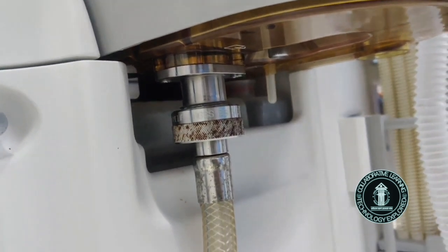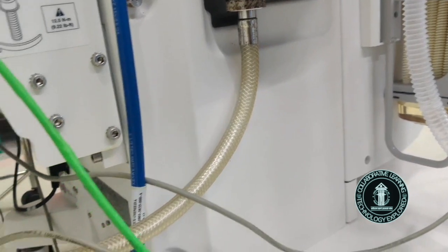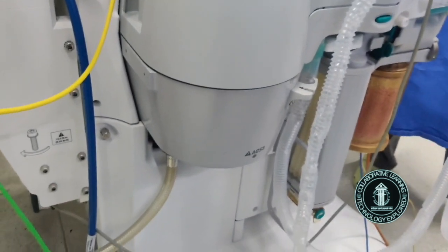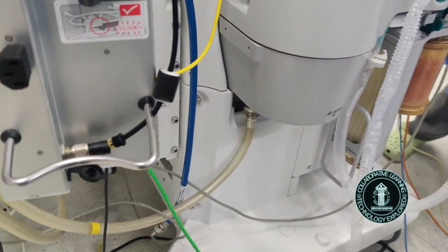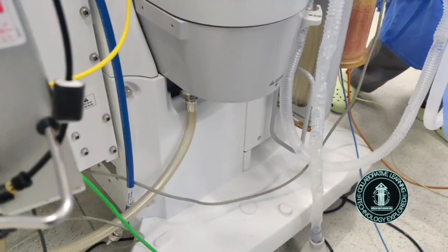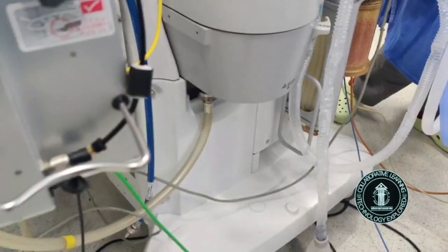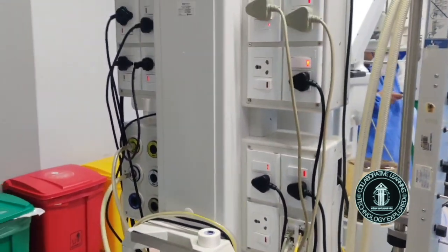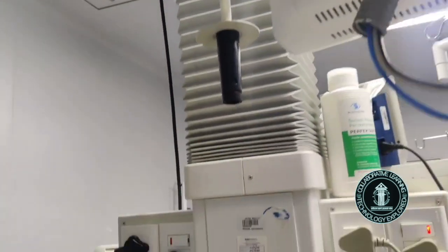And most of these disposal systems have a terminal unit, which is far away from the operating room environment, that may be placed on the rooftop or terrace. As we have explained, you cannot see the collecting or receiving system here because those parts are integrated inside this whole assembly. The excess anesthetic gases are collected inside the collecting system, from where the transfer system, this corrugated tubing attached to the lower part of the bellow, collects the excess gas and is connected to the AGSS port of this anesthesia pendant.